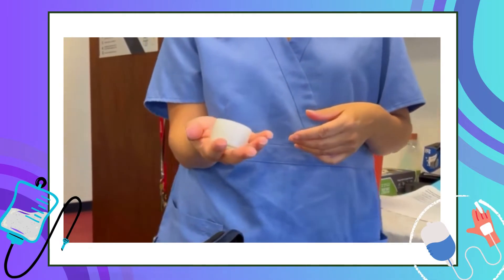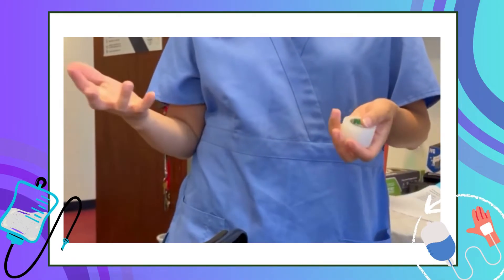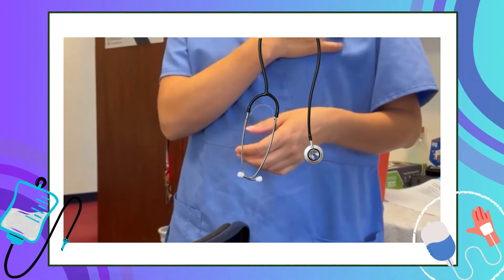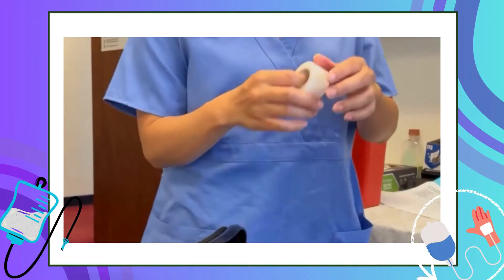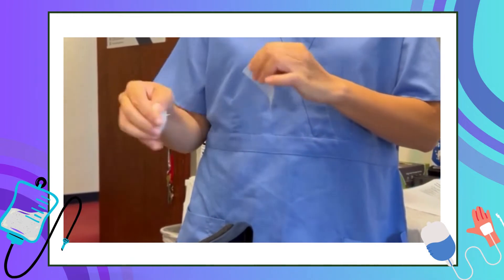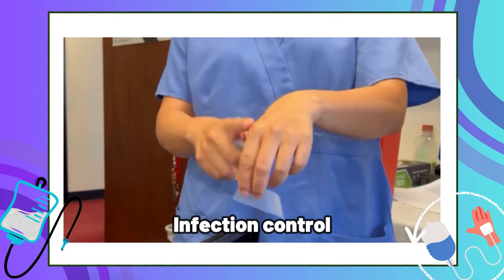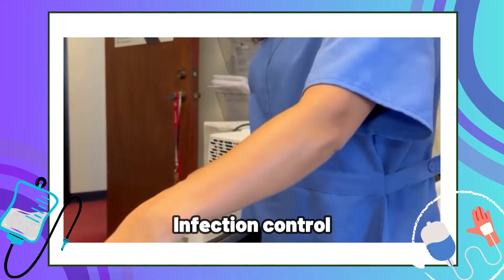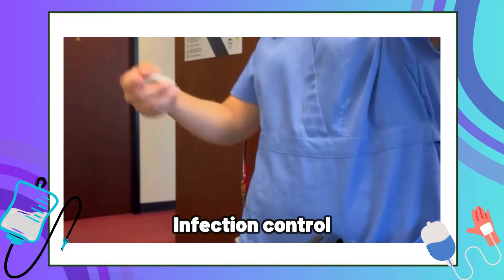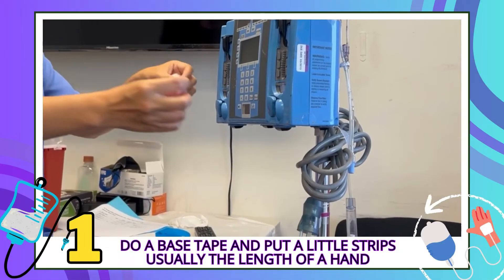Taping — this is my favorite one, the 3M transport tape. What happens with contamination with tape is that nurses put it in their stethoscope pocket. And also when you release the tape from the roll, people tend to put it on inanimate objects. Whatever is on the gloves stays on the tape, and then you put it on your patient's skin. So to prevent that, we want to do a base tape first.